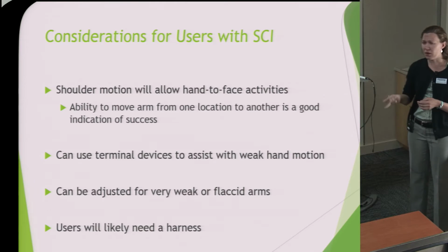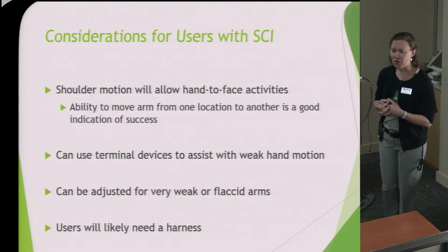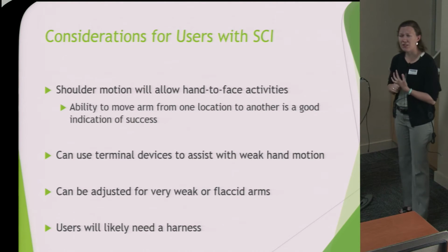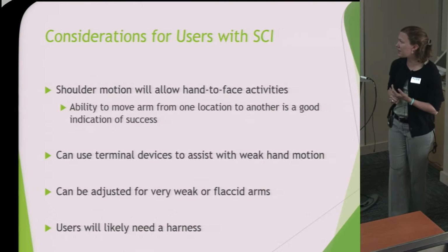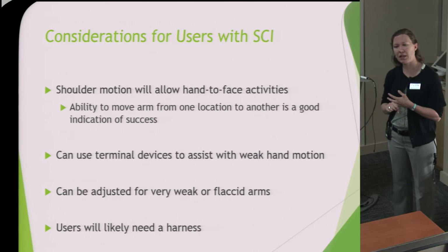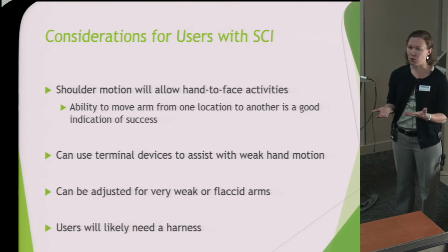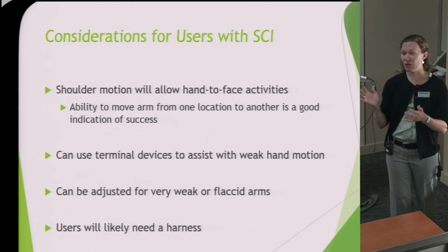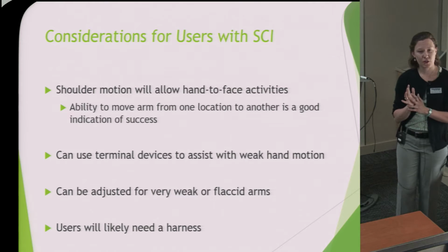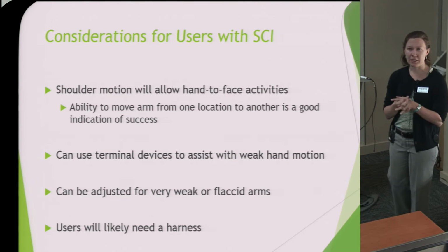Considerations for users with spinal cord injury. I know you guys are the spinal team, so I figured that's probably your largest group that you would be seeing. But again, shoulder motion is going to allow for hand-to-face activities. If they don't have hand function, we can still accommodate that to help them be functional. We can add what's called terminal devices in the world of orthotics and prosthetics. Essentially, we can give them a clip-on fork, a universal cuff that they can put devices into, something of that nature to basically give them functionality at the hand.